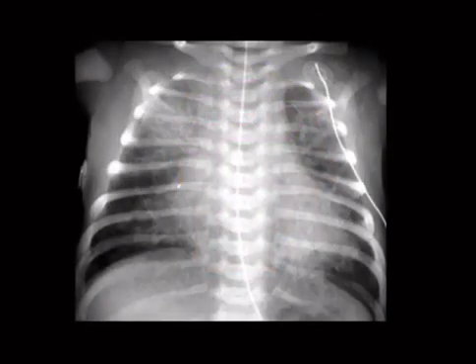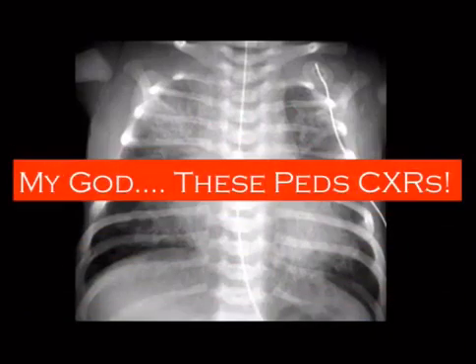All right, moving on to the chests. These are really tricky, right? People hate these things. I'm going to try to make it simple, at least for multiple choice. That's the nice thing about multiple choice, is that you don't actually have to know how to read these things. So here's one of my strategies. I like to look at the history that's provided, if they're nice enough to give me any. So let's do some buzzwords.